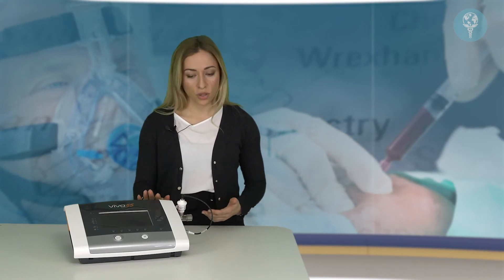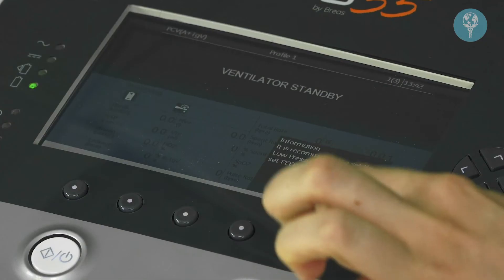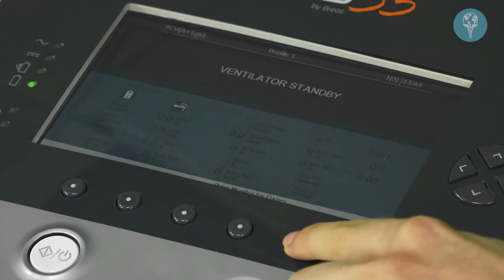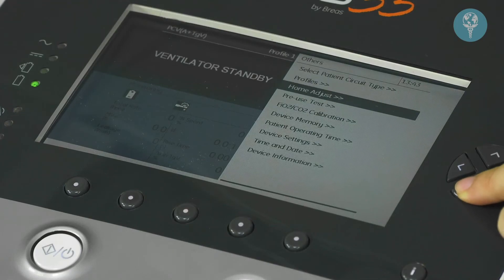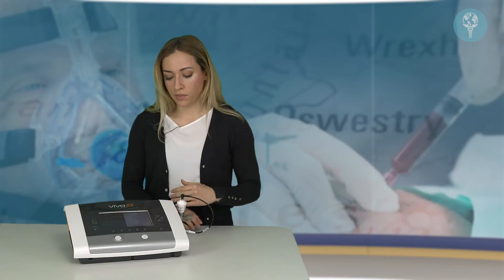First you'll need to switch on the ventilator — one push of the button on the side. Then to access the calibration in the menu, go to the Others menu and push that button once. Scroll down with the down arrows until you get to FiO2/CO2 calibration, then push the arrow to select that, and the device will take you through a step-by-step process of how to do that.